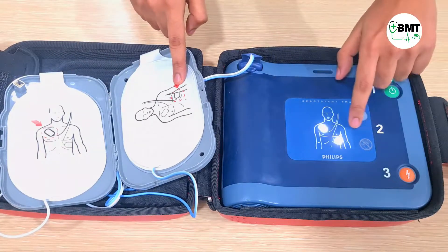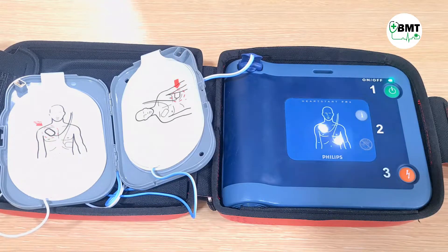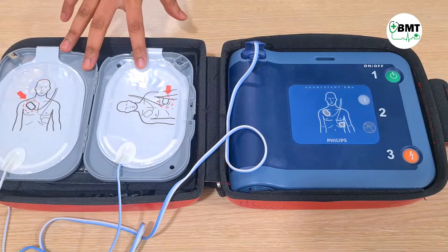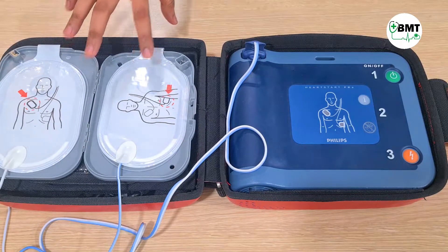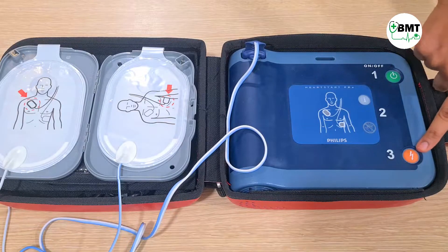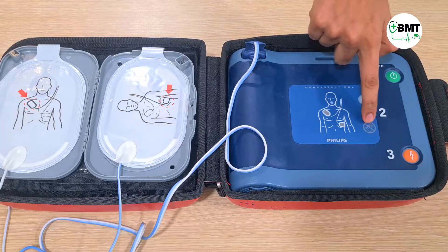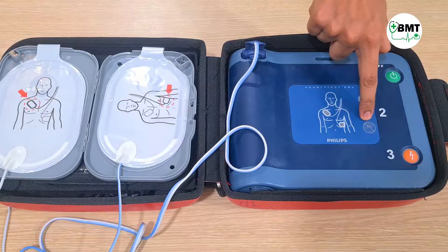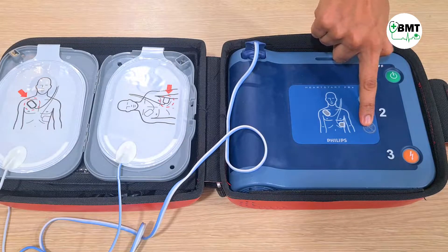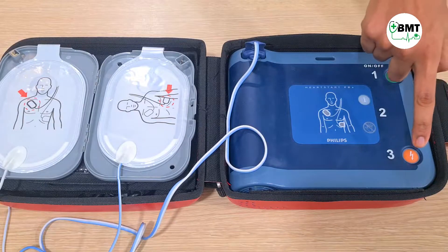When the first pad is in place, peel the second pad and place it exactly as shown. Once these pads are placed on the patient, this indicator will start flashing. While it is flashing, stay away from the patient. If you press the shock button during this flash, the shock will not be delivered. You have to wait till the flash indicator stops. Once it stops, the orange button will start indicating — then press the shock button.